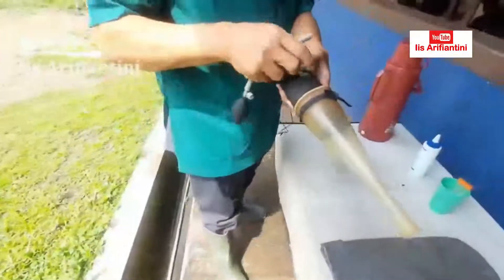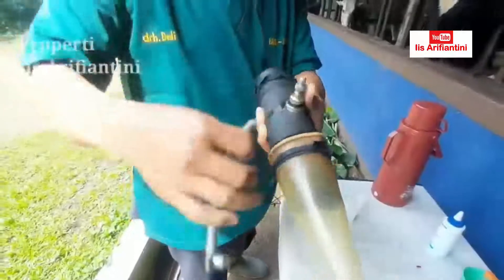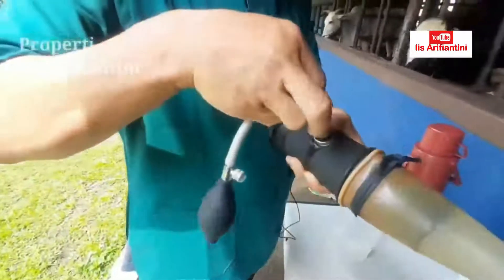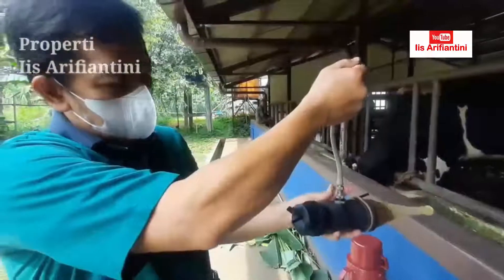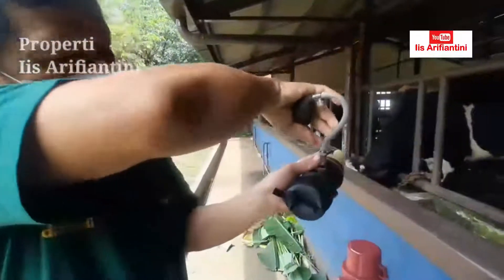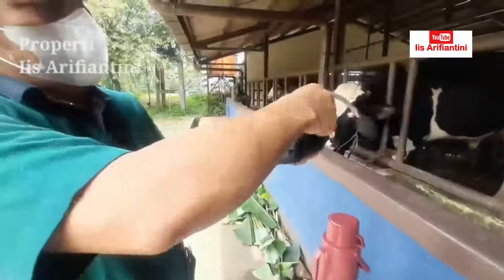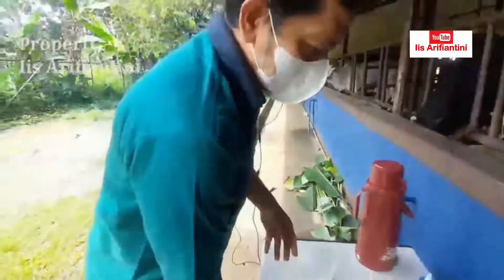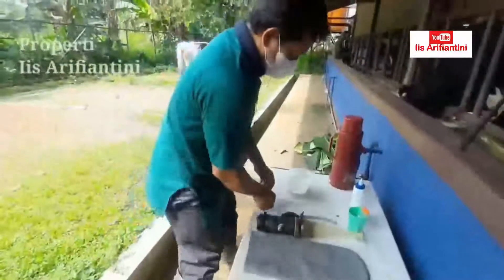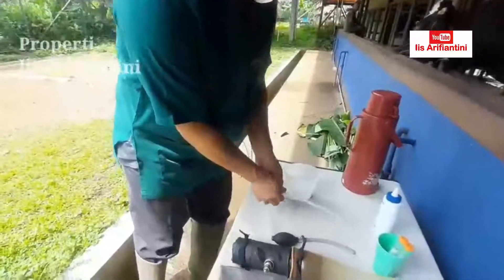Jadi kita masukkan ke dalam vagina buatan, sudah penuh. Setelah itu kita tiupkan udara ke dalam vagina buatan seperti ini — di pentil bagian atas kita buka, kemudian kita tiup. Sehingga dia akan mengembang dan hampir menyerupai vagina. Suhu akhir yang kita harapkan dari vagina buatan ini adalah 42-45 derajat Celsius, sesuai dengan suhu pada saat si betina sedang estrus.